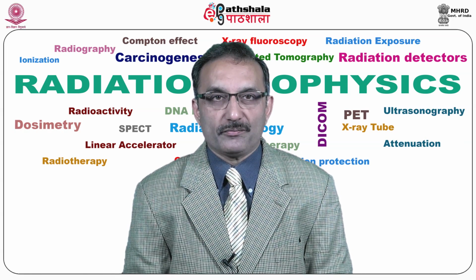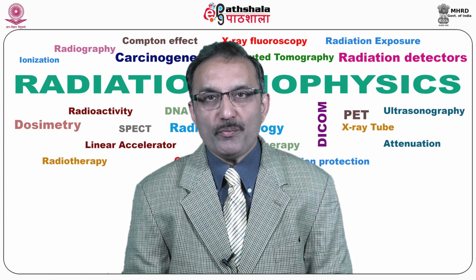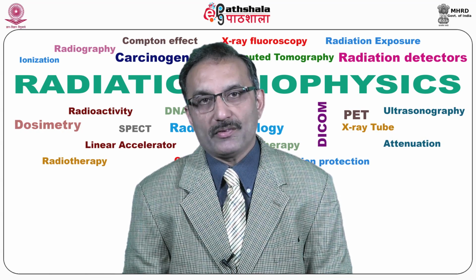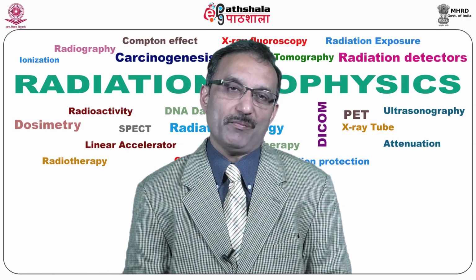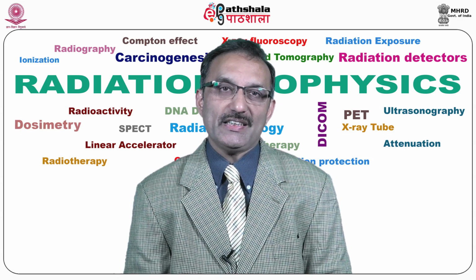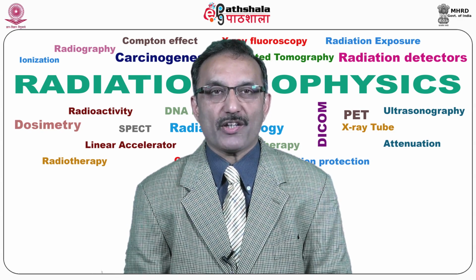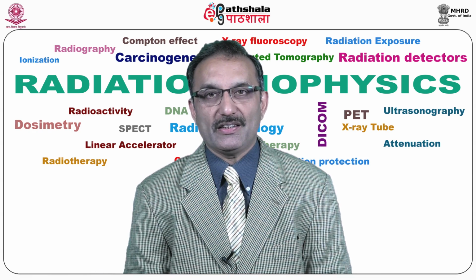human body. Newer devices available may be able to perform 2 imaging studies at the same time, such as SPECT-CT and PET-CT. What does it mean? It means it's a hybrid technology where the CT has been combined with the gamma camera or SPECT and PET, and this is called SPECT-CT and PET-CT.